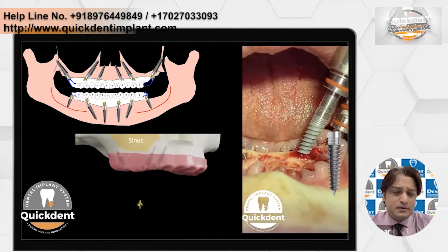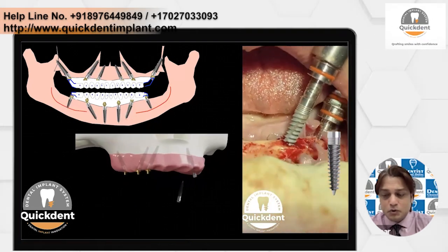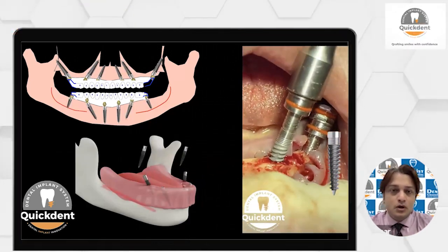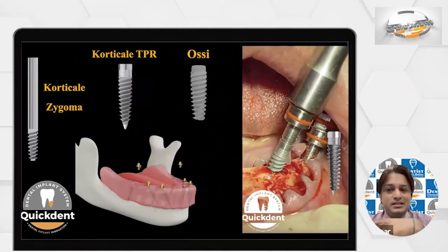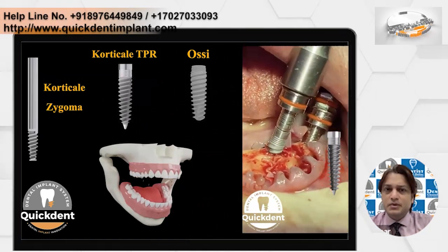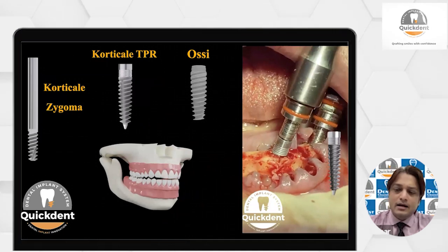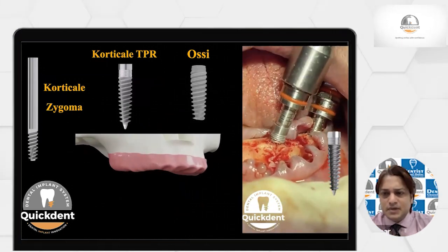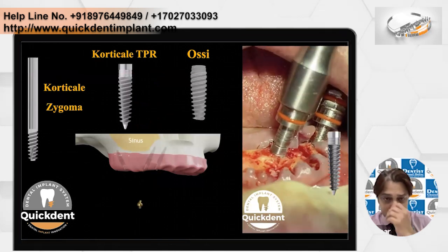It is conducive to engage the basal cortical bone, so immediate loading is still possible in the majority of cases. Whatever cases I show you will use these 3 implants: zygomatic implants, the TPR implants, and of course the OSSI, a standard conventional implant.